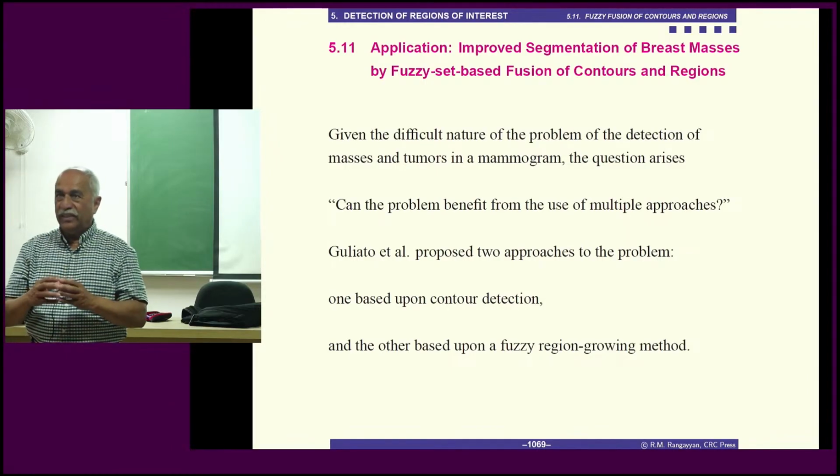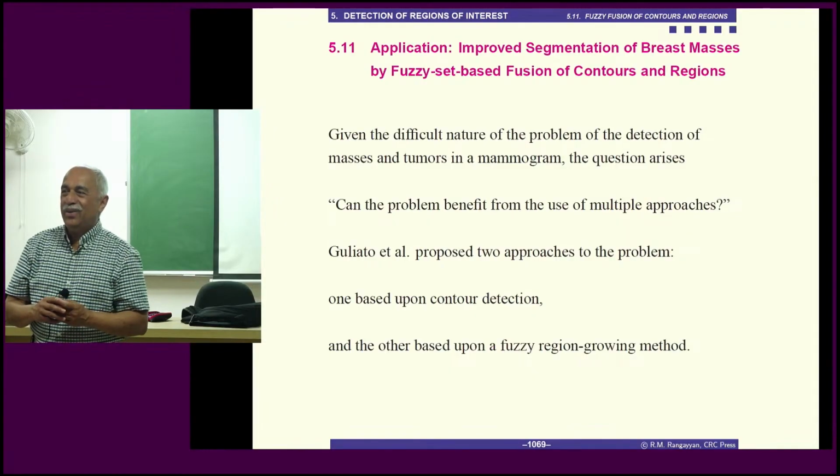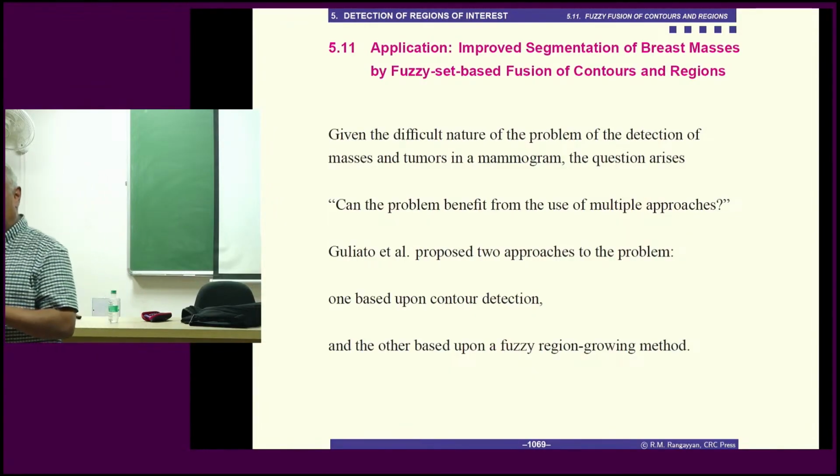Along with Gabor filters, I can't think of which other filter you would put, but it depends on what you want to detect.